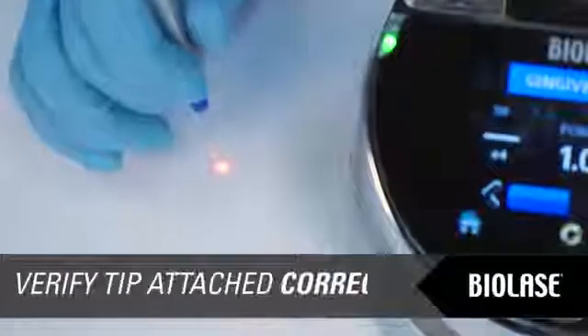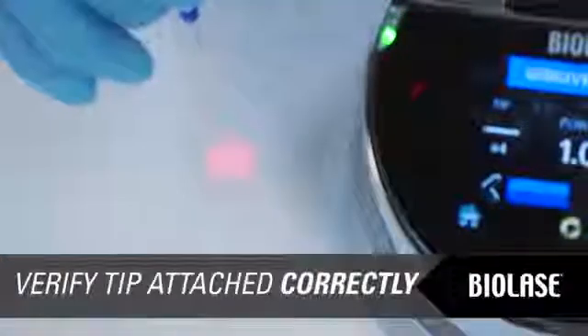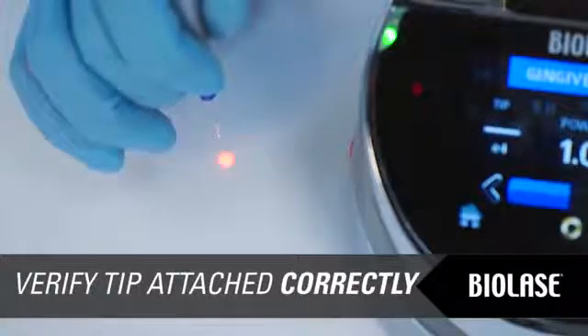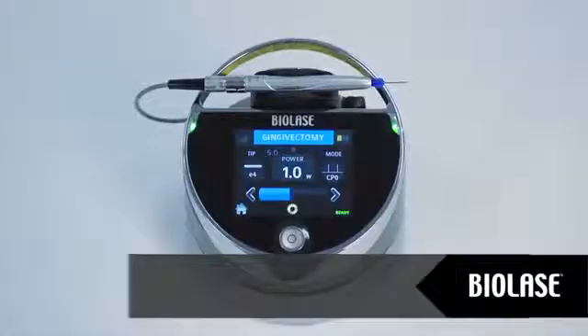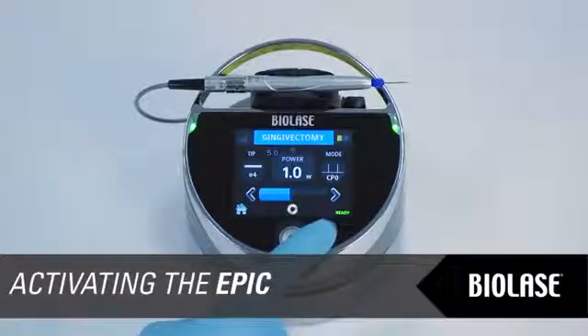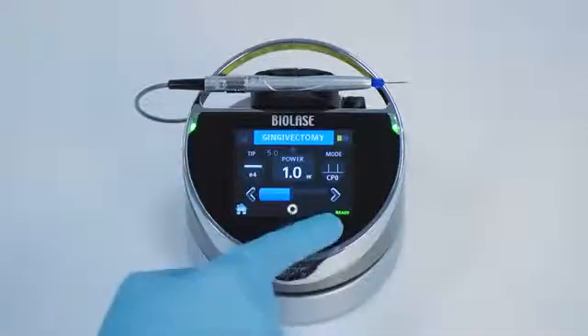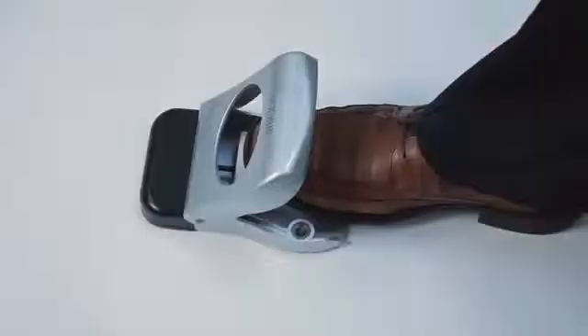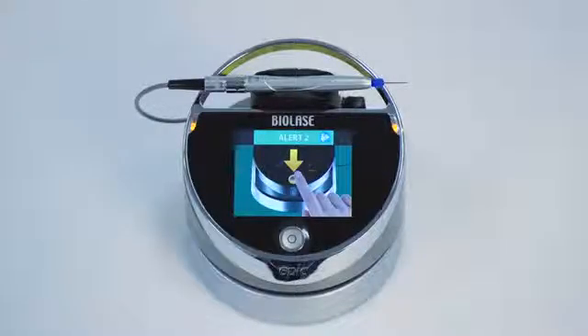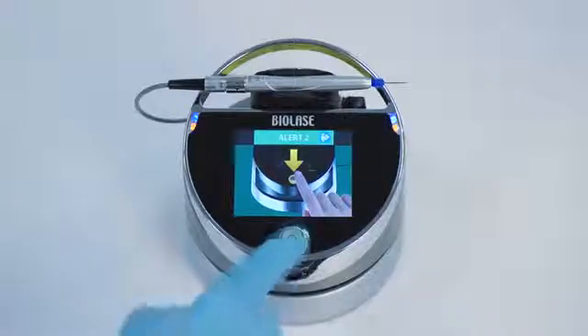To check if the tip is properly attached, shine the aiming beam from a straight tip — without pressing the foot switch — onto a surface such as a tabletop. If the red aiming beam makes a pattern of a circle, the tip is connected properly. The EPIC can be activated only when it is in ready mode, noted by a green LED on the console, the word 'ready' in green letters in the lower left-hand corner of the display, and the appearance of the red aiming beam from the end of the tip. If you press the foot pedal while EPIC is in standby mode, you will see an alert screen. To clear the alert screen, press the control button and the laser will enter ready mode.